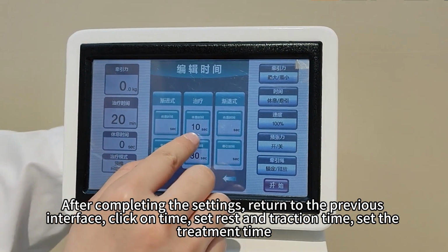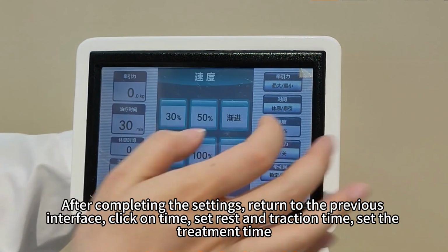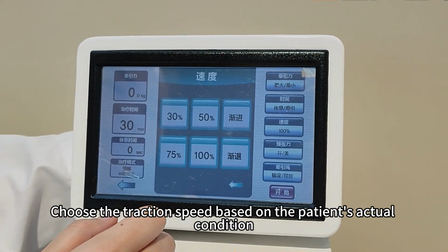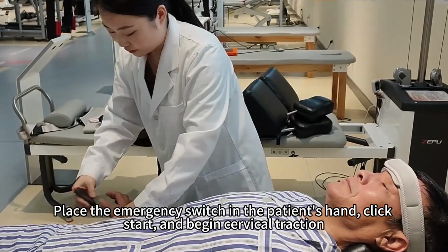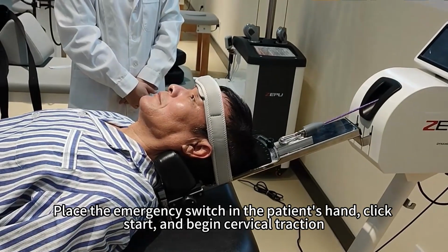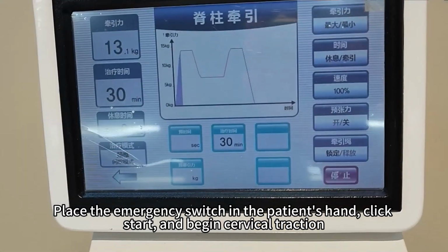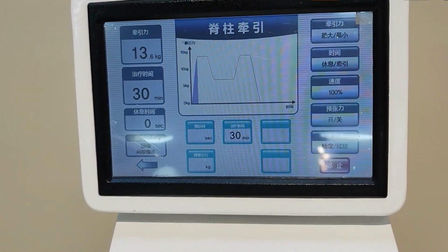Click on Time. Set rest and traction time. Set the treatment time. Choose the traction speed based on the patient's actual condition. Place the emergency switch in the patient's hand. Click Start and begin cervical traction. The screen displays real-time traction force.